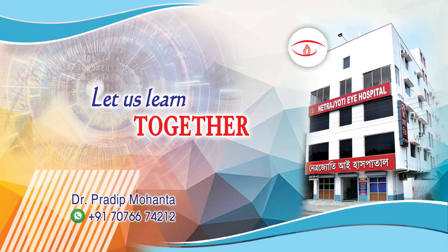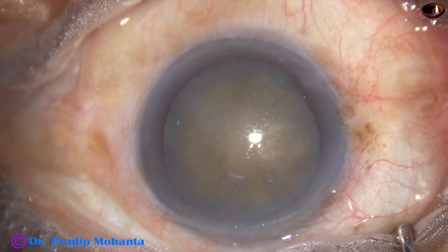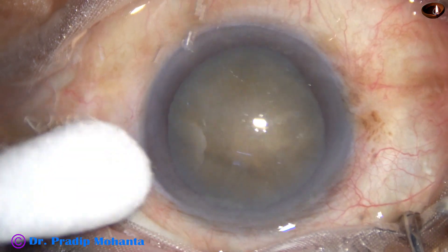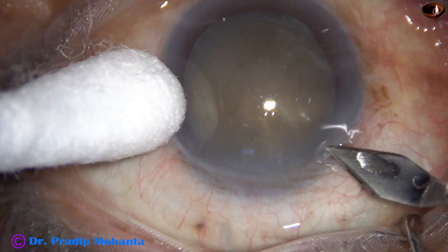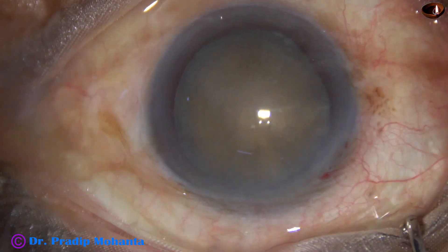In this video we are going to see management of a very hard nucleus by submarine phaco. This is a cataract with grade 5 nuclear sclerosis. This is the main incision with a 2.8 millimeter steel keratome at mid-limbus.